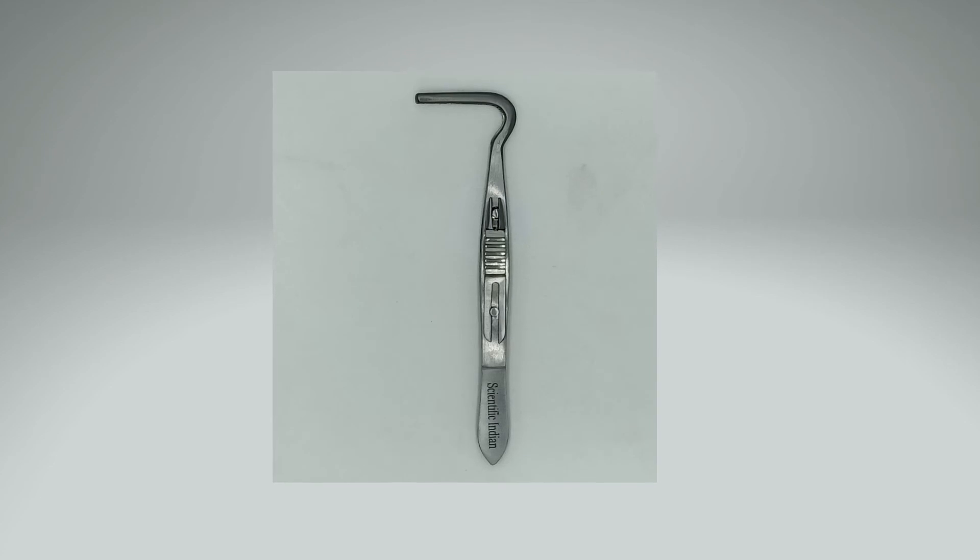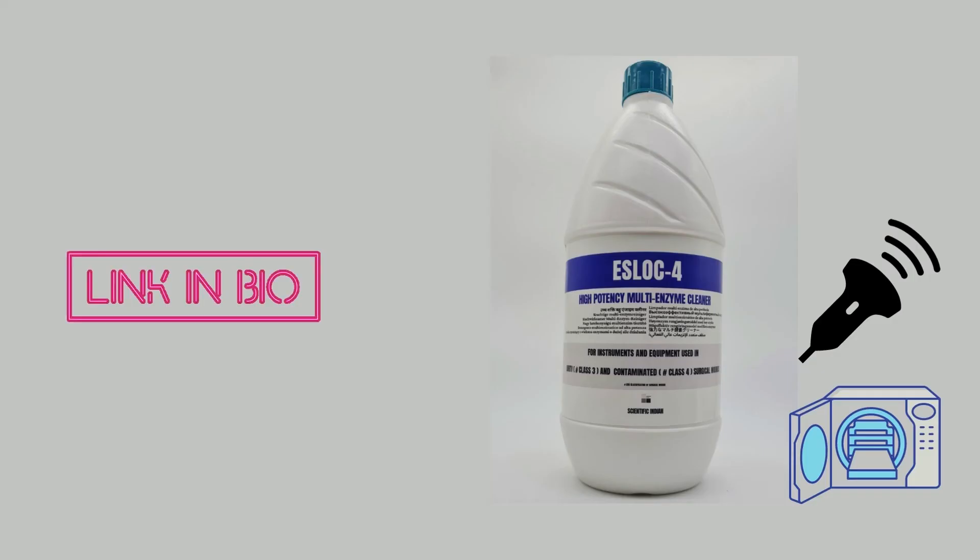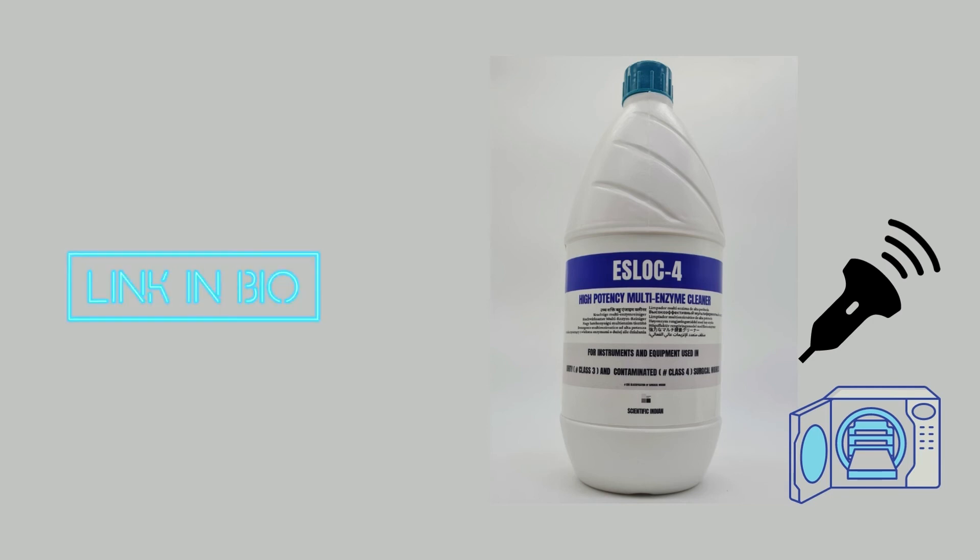These are high-quality instruments made from surgical grade stainless steel and are handcrafted by trained instrument makers. The instruments are reusable and autoclave safe, and are also safe for cleaning by enzymatic cleaners and ultrasound cleaning.